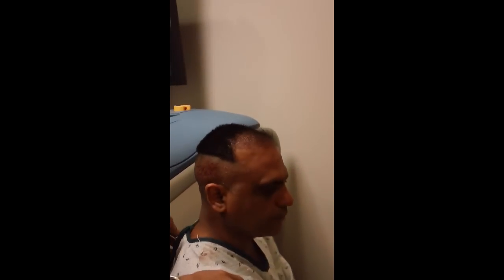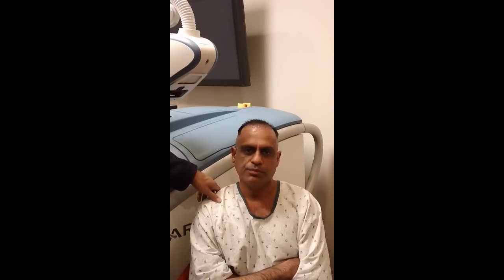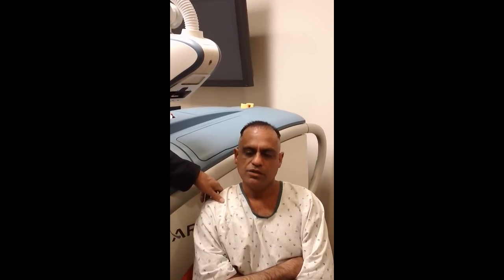Turn around again Ali. What do you think about the procedure from what you had before the FUE to this procedure? Was it any different? A lot different because I didn't feel no pain at all. I didn't have to take no painkillers. Previous procedure I had to take some painkillers like Vicodin and some shots. Also I had Valium. This time I had nothing.